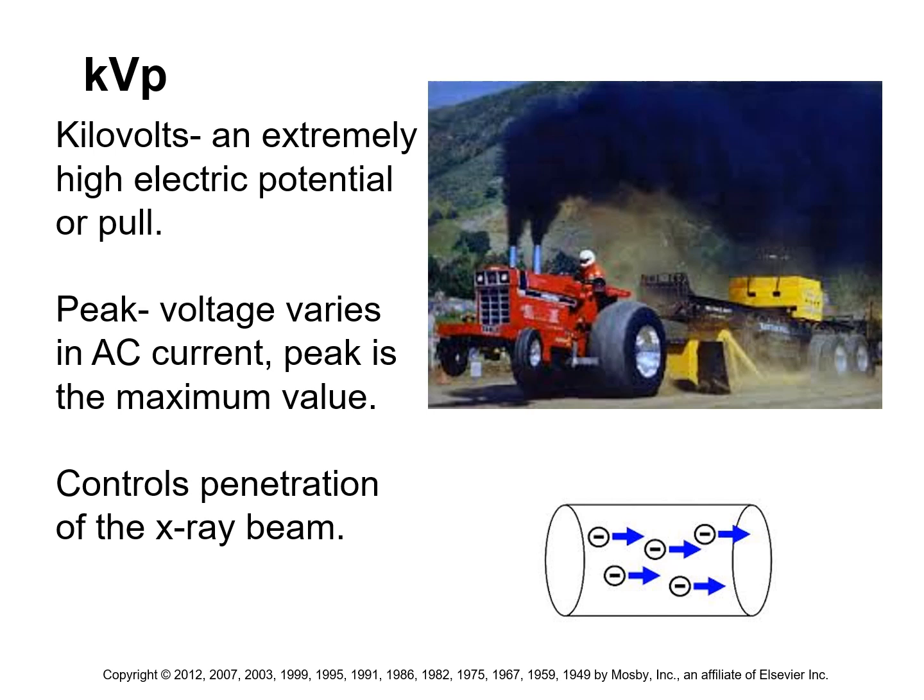Okay, so why are the electrons flying through the wire? It's because we're pulling on those electrons with a certain force. That force is called voltage. The more forcefully we pull on the electrons across the X-ray tube, the more energetic our photons become. Now, we'll explain exactly why that's happening at the end of the physics course. For now, just understand kilovoltage means penetration power.